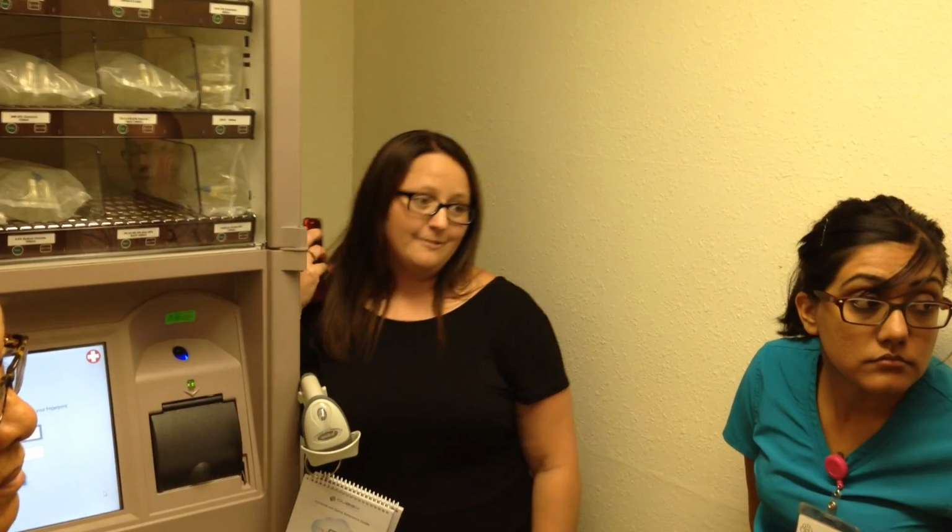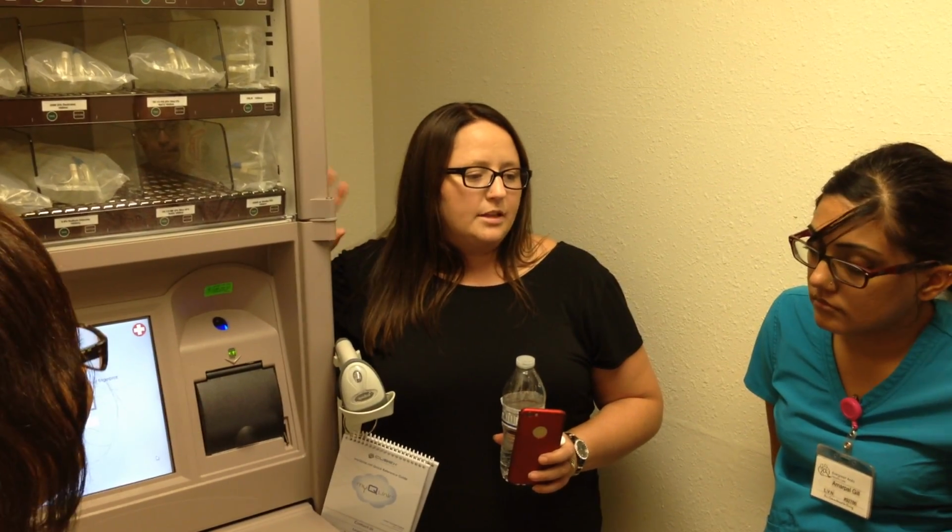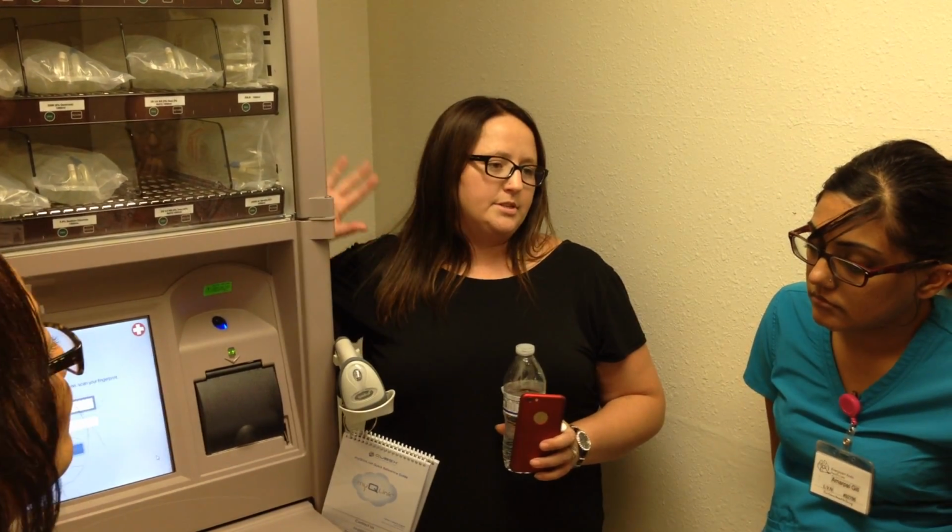So we'll still have narcotics on our cart? Oh yeah, this is just extra. This is our e-box, first dose emergency kit. So it's exactly what you do with your tackle boxes, except now in a machine.